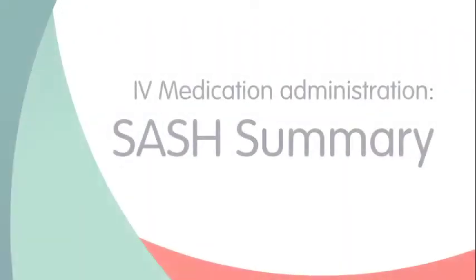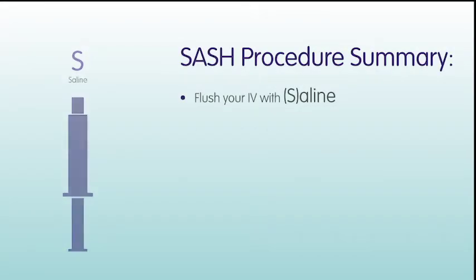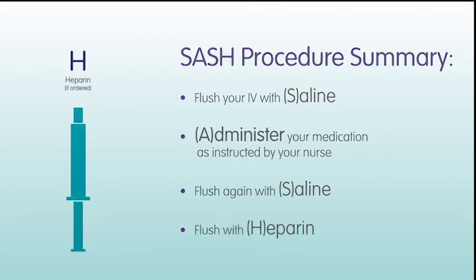Here is a SASH procedure summary to ensure you are administering your IV medication effectively. Flush your IV with saline. Administer your medication as instructed by your nurse. Flush again with saline. Flush with heparin.